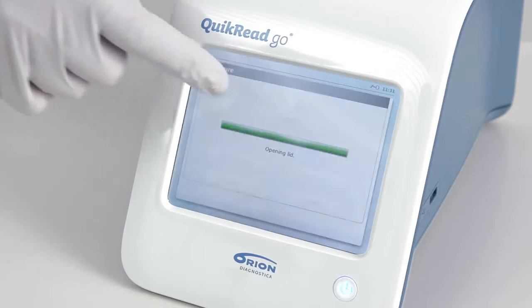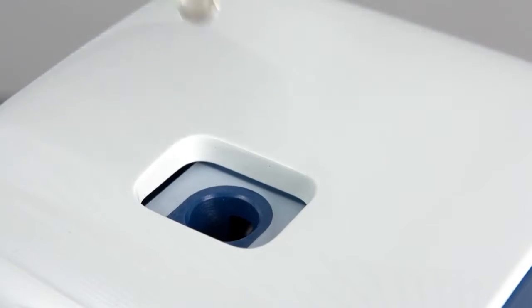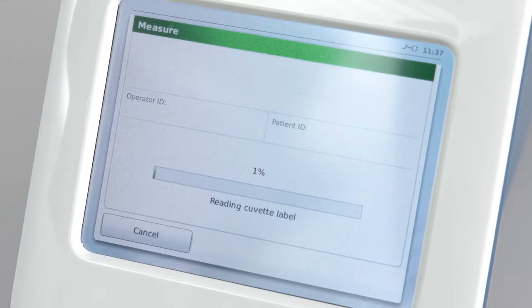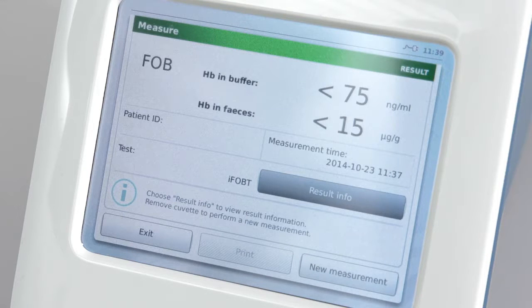Choose 'Measure' from the display of the QuikRead Go instrument and follow the instrument screen for instructions. When the instrument guides you, insert the cuvette into the measurement well. The instrument starts measuring the sample and you can follow from the screen how the measurement is proceeding. The test in use is also shown on the screen. When the measurement is completed, the result appears on the screen in the way you have chosen — qualitative or quantitative. The results are automatically stored in the instrument's memory.